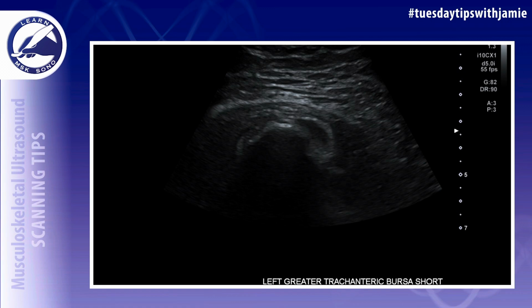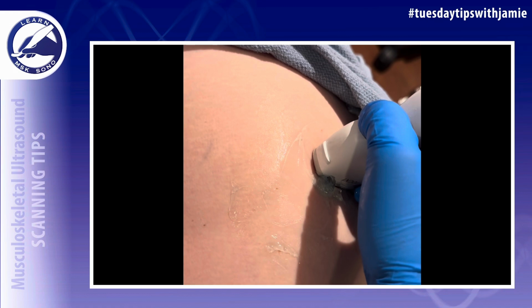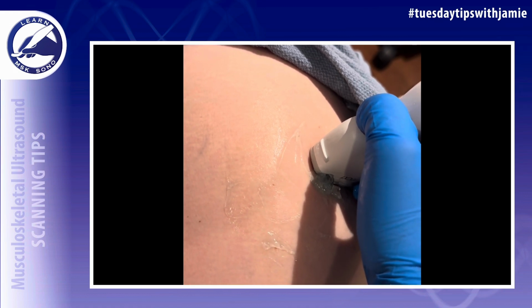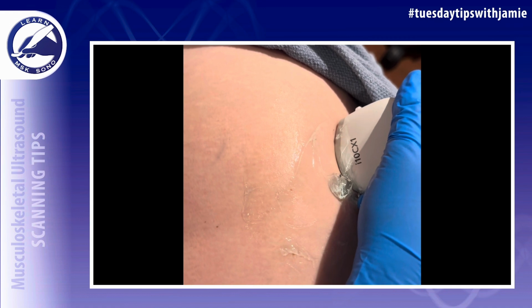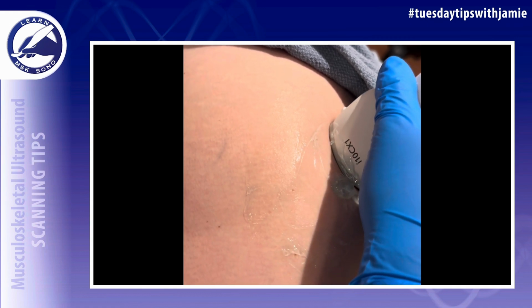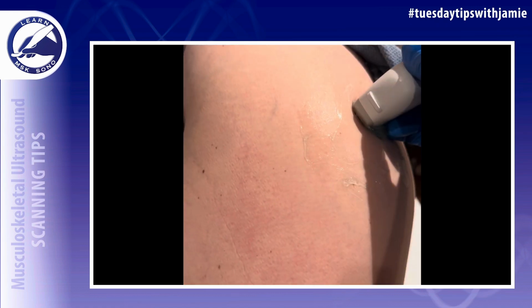When you're evaluating the greater trochanteric bursa for bursitis and you get an image that looks like this, you should rotate the transducer to see if the hypoechoic structure elongates like a tendon should before you make your diagnosis. This will help you differentiate anisotropy of the gluteus medius tendon from greater trochanteric bursitis.